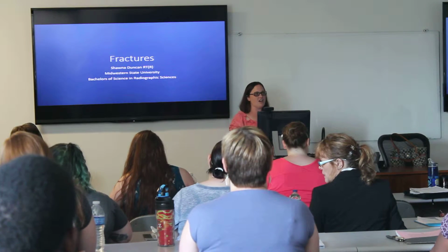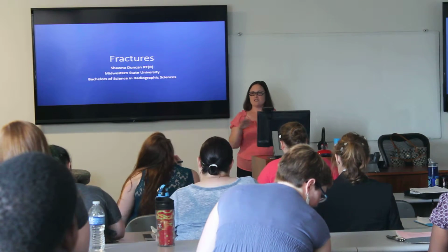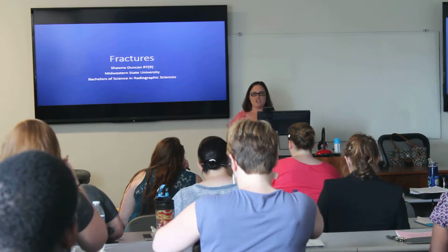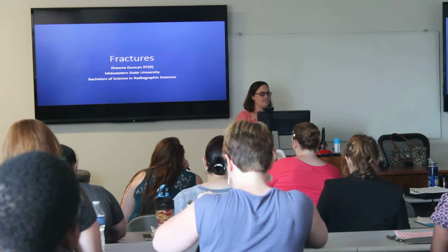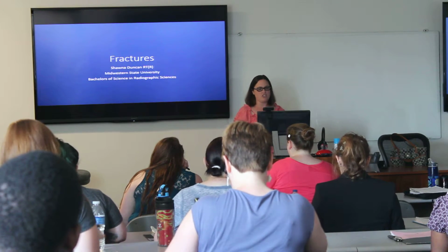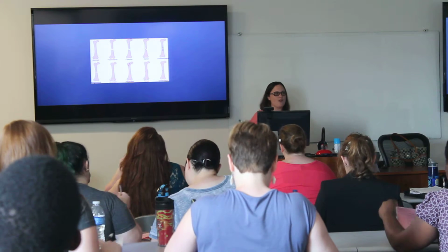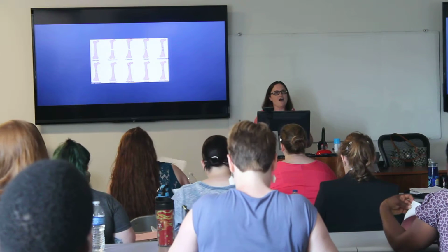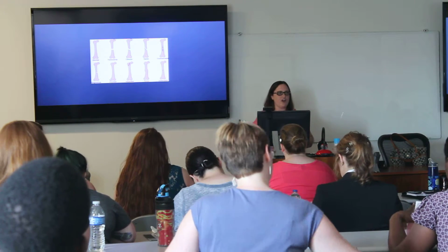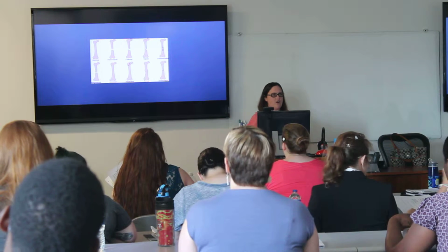All right, we are going to talk about fractures today. I know this is your first term, you're just starting out, but this is some real general information about fractures and some things to keep in mind, especially when positioning a patient who might have a suspected fracture. All right, so you have all sorts of fancy screens, whichever one is close and good for you. The very first picture is going to show just a normal bone. We've got very nice smooth borders, no visible fractures or anything going on.